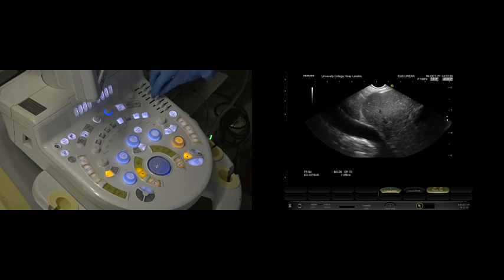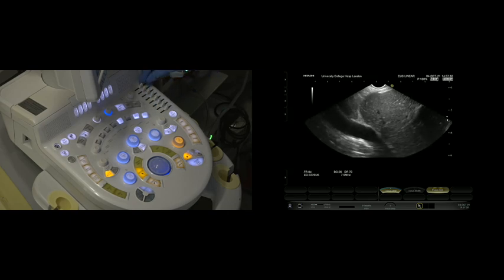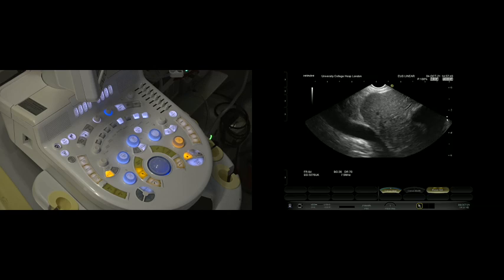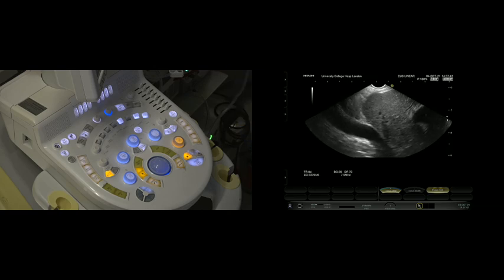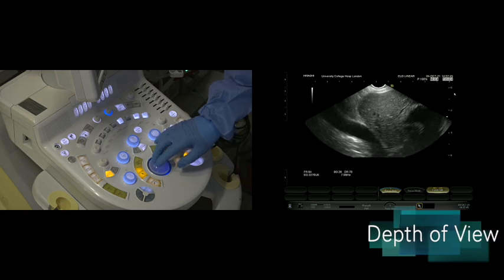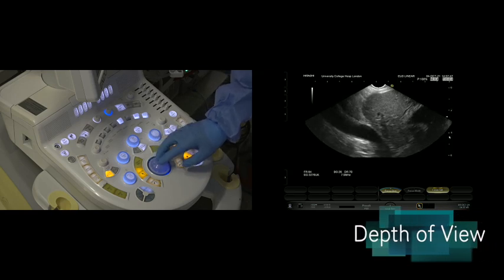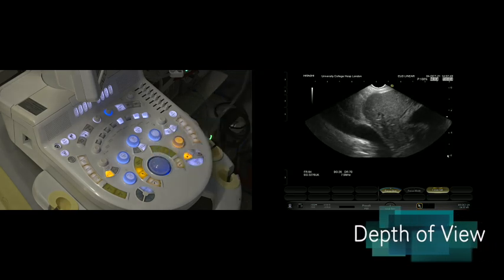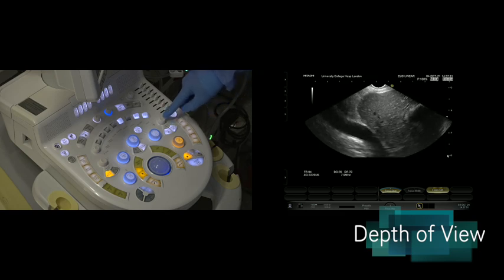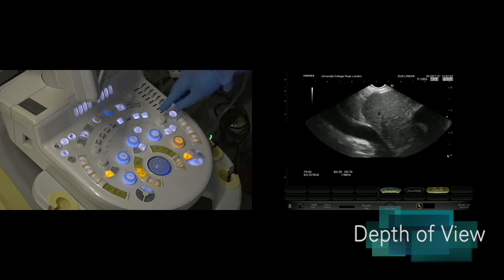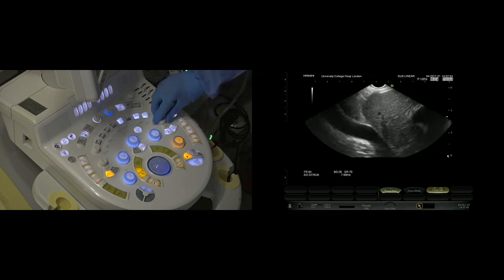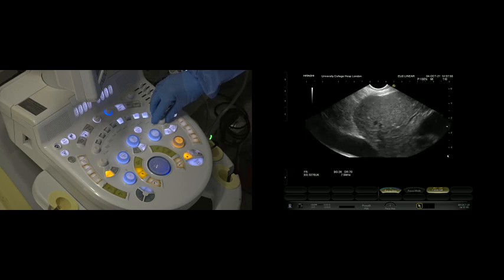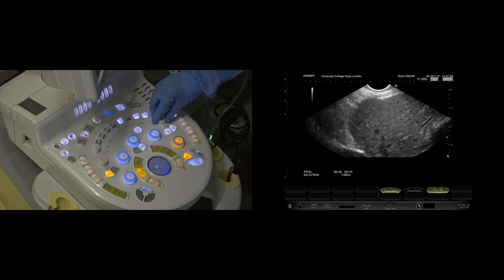The next thing is the depth of your view. We see on the right-hand side here we've got these numbers, this is the depth in centimeters. So we go down to six, and the depth mag is this button here on this particular system. If we dial that clockwise, we're reducing the field of view.